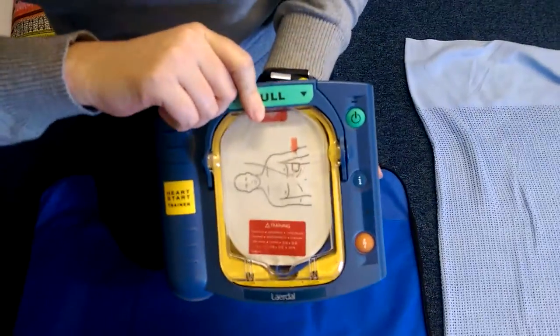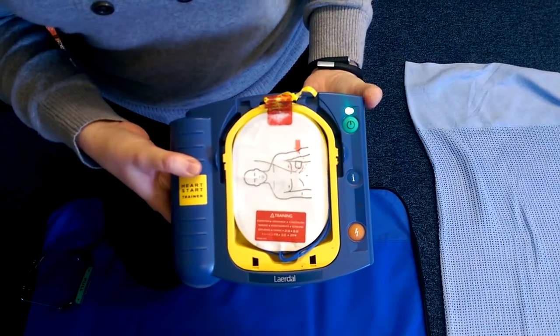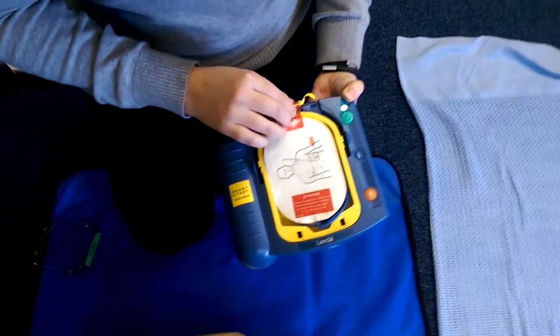The device says: 'Begin by removing all clothing from the patient's chest. Cut clothing if needed.' This is so we can get a good electrical contact.